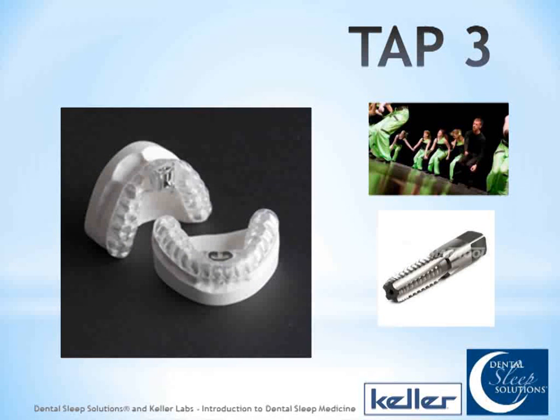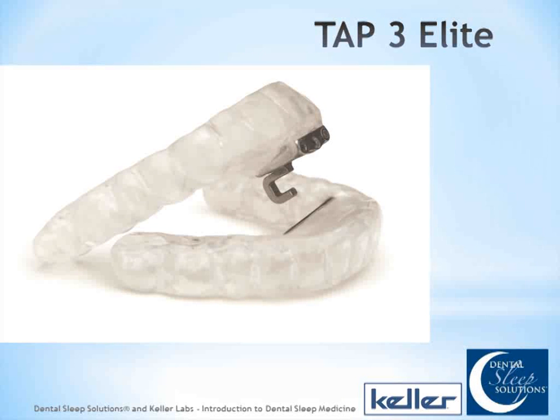So, of course, we have the TAP 3 Elite also, and Keller's one of the few labs that can actually do this right now. Labs have to go through a certification process in order to do this. And it's a little bit different. I like the bar on the bottom. They've gone back to that. I used to take the old TAP 2s and the little socket that they made and just throw it away and put a bar in like that. So it gives them a little more side-to-side movement. And the upper hook is now replaceable, so you can add vertical and add anterior, posterior as well, just by changing that.